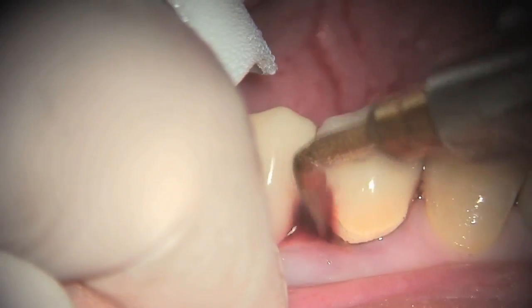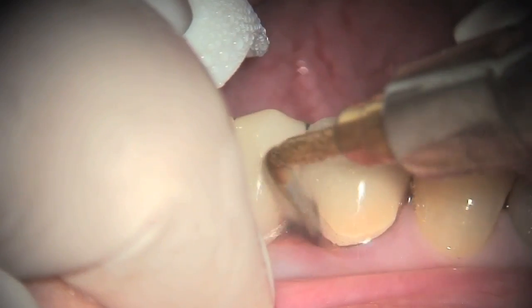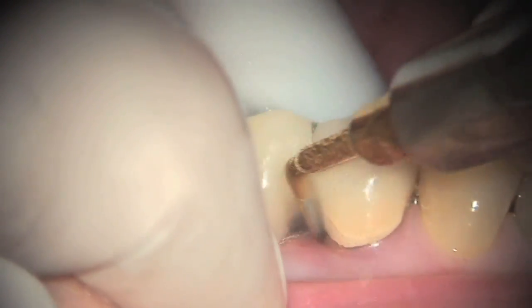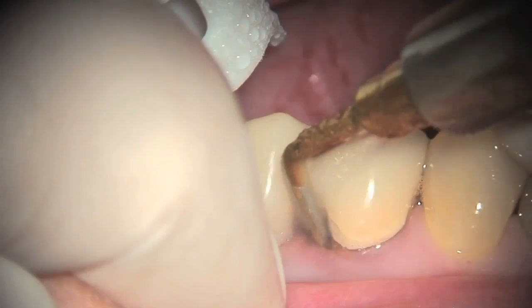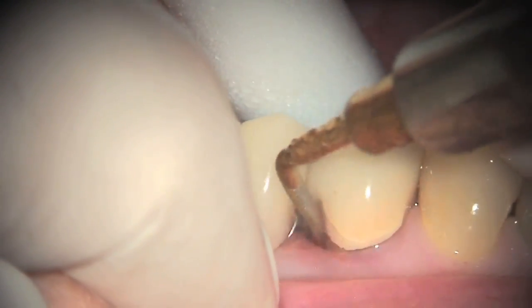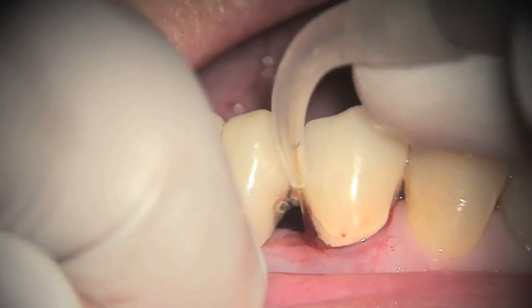The erbium laser PIPS effect removes most of the calculus and softens it so that the ultrasonics can remove it very quickly and very easily. If you don't get all the calculus off, you will not get the results. Be sure to use a very soft touch with the ultrasonics because they are noted to dig in to the root surface.